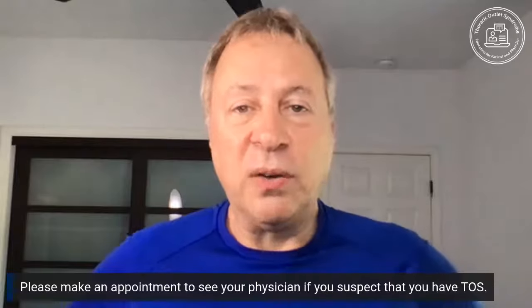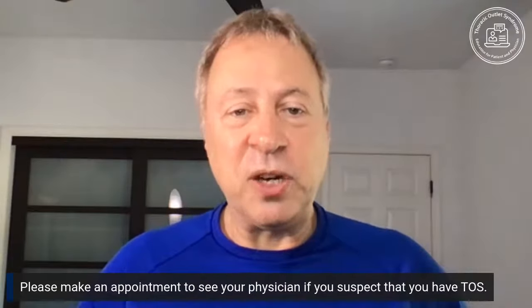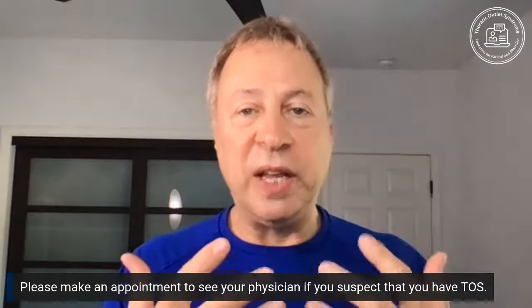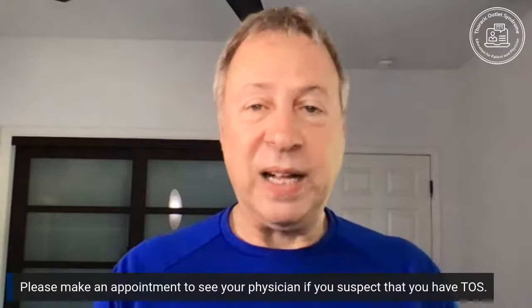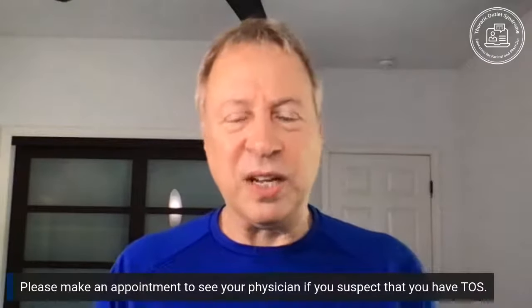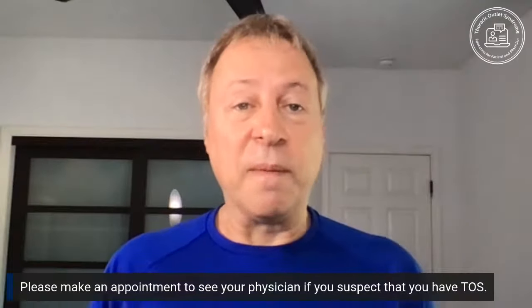Many of you may have heard of MR neurography. There's a clinic in Santa Monica, I don't mind mentioning their name, the Neurography Clinic, and they provide a service where they'll isolate the nerves and look at them by themselves. Now, it's a really pretty picture, and a lot of radiologists like to look at it because it's just the nerves. You can accomplish this in a lot of ways. You can do it through their patented method, and you can do it other ways which aren't patented.